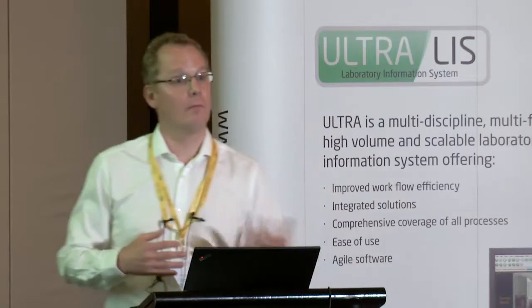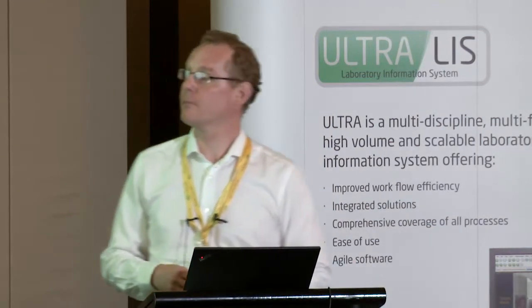each case that gets pre-allocated to an individual pathologist can only really be reported by that individual. So when that case comes out of the laboratory, it's waiting for that pathologist to do it. And likewise, that individual is waiting for their work to come out of the lab before they can do it. They can't do anyone else's work. And both sides of that equation are inefficient. You lose time on both sides of that equation.